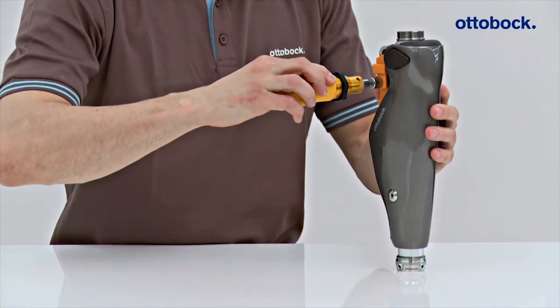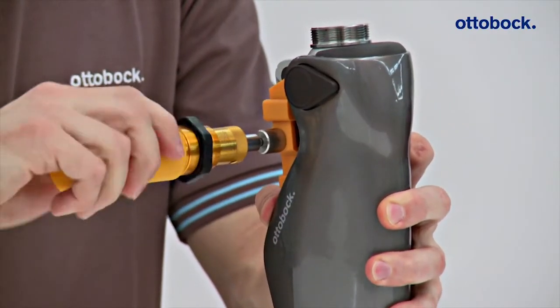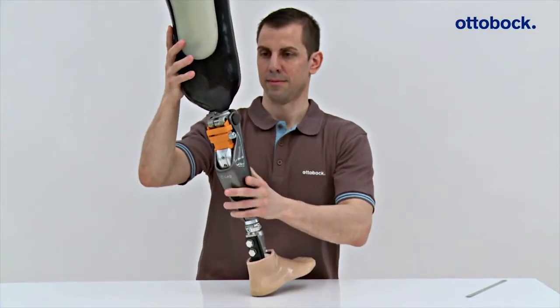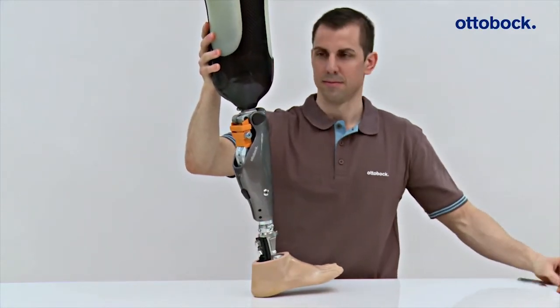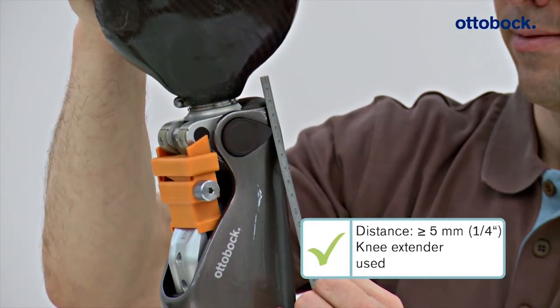The knee extender must be applied during bench alignment of the C-Leg 4 to simulate a loaded prosthesis. There must be at least 5 mm of space between the socket and main electronics even when the knee extender is applied. This is the case here.